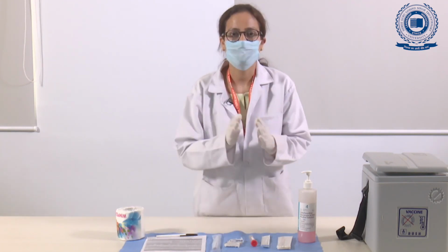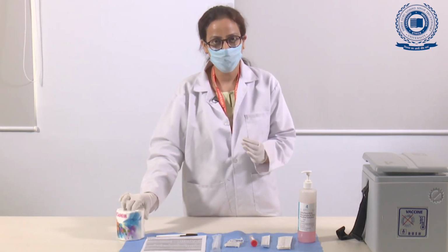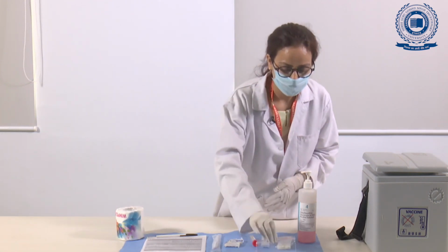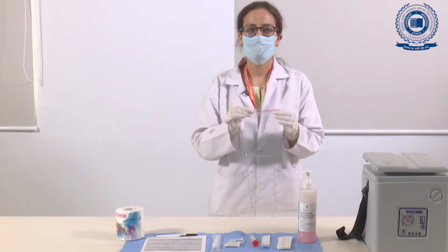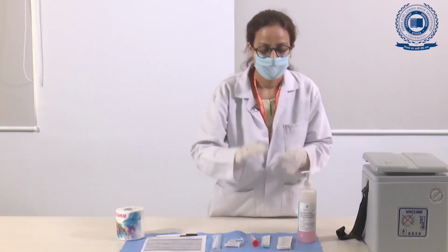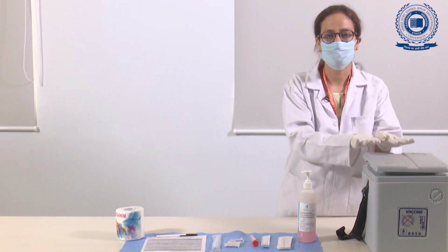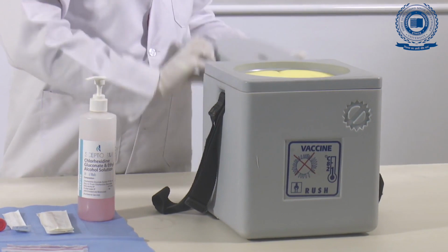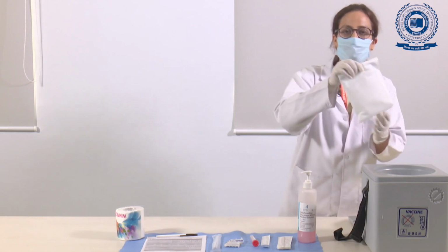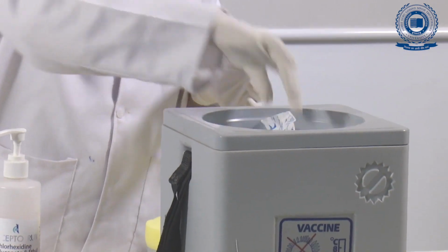Then after the primary receptacle is ready, we are going to seal it with either tissue or absorbent material like cotton. Then we are going to pack it into a secondary receptacle, which is either a plastic Ziploc bag or a container which is leak proof. Then when it is packed, we are going to transfer it into a third, that is tertiary receptacle, which is provided with gel packs which will maintain the temperature of the sample between 2 to 8 degrees Celsius.